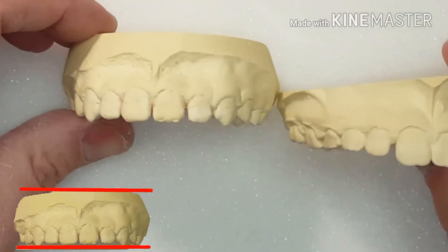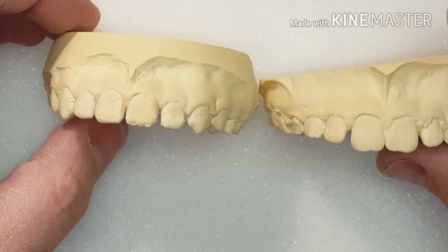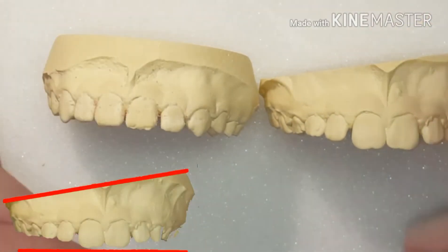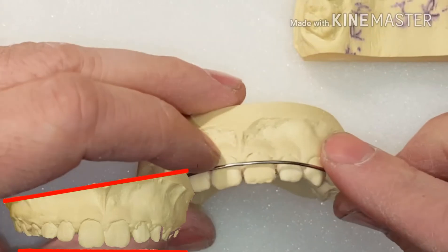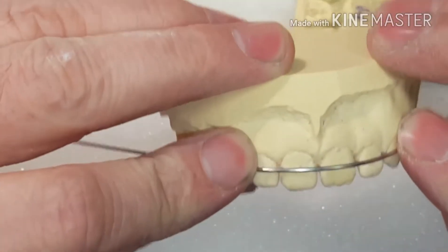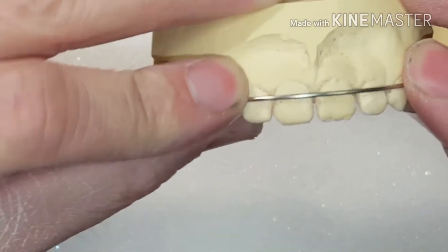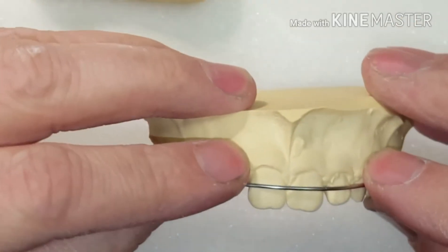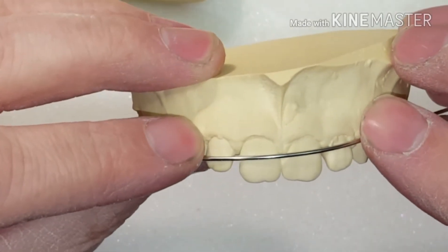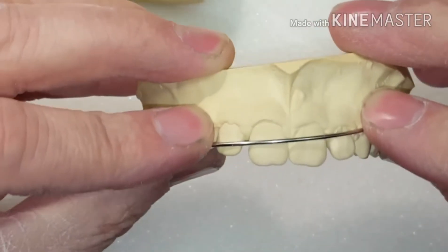For instance, you can see that this model is crooked. So every time I go to bend a retainer wire, I want it to be nice and straight so everything's parallel. So when the doctor looks at it, the very first thing the patient and the doctor see is, wow, that looks really straight — my teeth will look really good. If you get in a bad habit of starting off and everything's not parallel, your wires will start to drift and it looks a little crooked and not parallel.